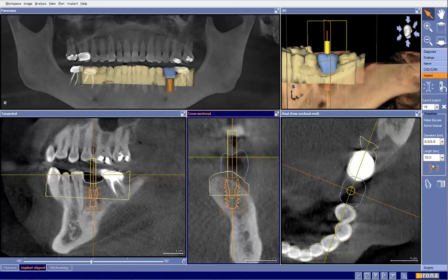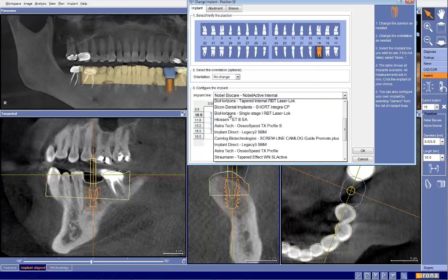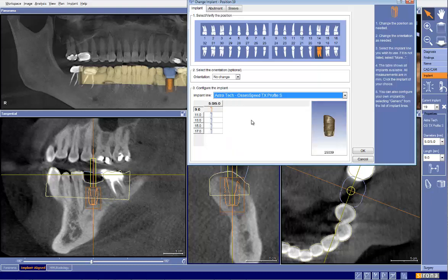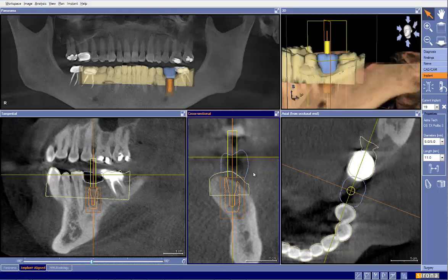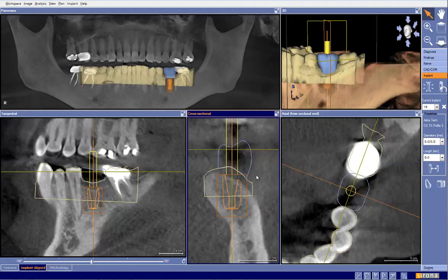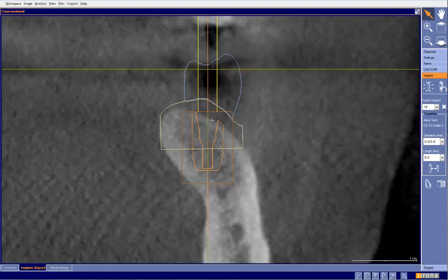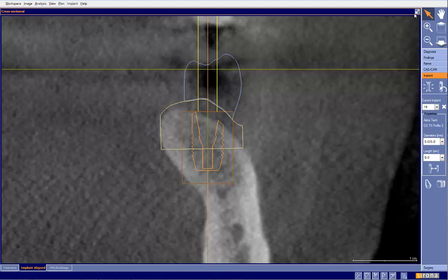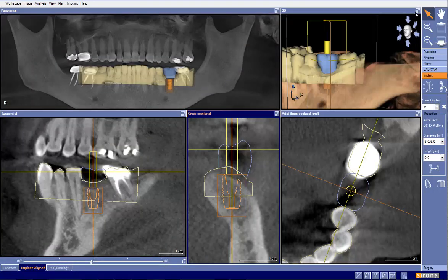One other thing I'd like to point out is the use of an alternative implant. In a case like this, we can always look at using the Astra Profile implant. It has a sloping head, which would allow us to avoid any type of grafting in this particular case. It's a little more difficult implant to use — you have to get the timing and orientation correct — but I always believe in understanding and having a few more options available to you. Other than the CEREC drawing and some slight positional changes on the implant, I think everything looks pretty nice. Thank you for sending the case in.